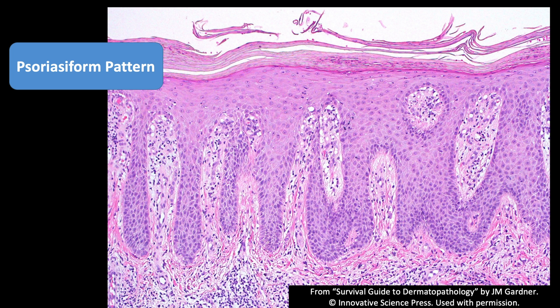The first thing you'll notice is the epidermis is thickened — we call that acanthosis. In this case, acanthosis is not just thickening the epidermis, but particularly the rete ridges are very long and they kind of have a test tube shape. Sometimes they bulge at the bottom and have a club shape, and sometimes they fuse with their neighbors, like you're seeing here.